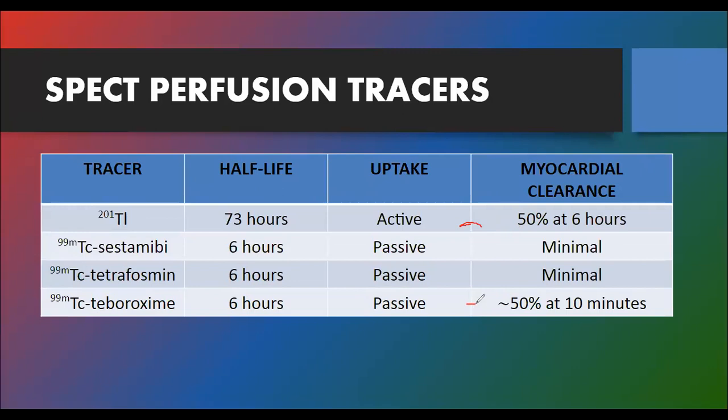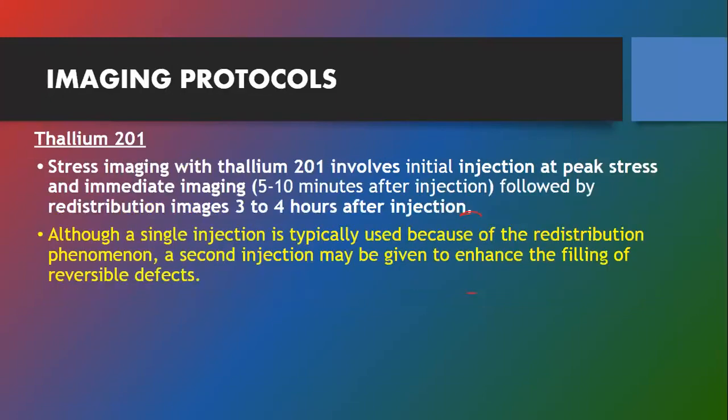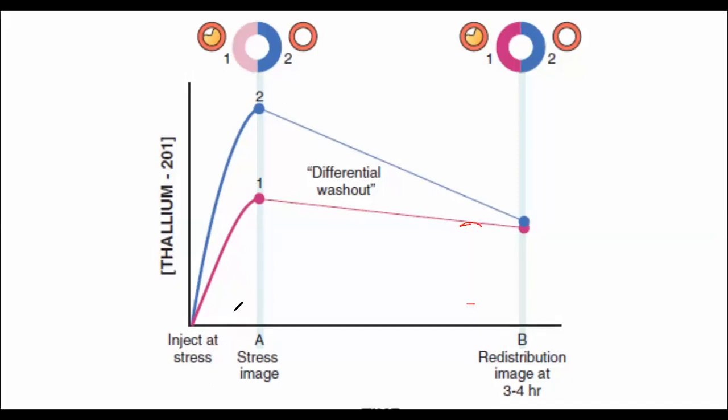As blood flows through the myocardial cells, after the tracer has entered, see this is showing the isotope entering into the myocardial cell. The red one is showing a diseased myocardium having lesser blood supply because of some coronary stenosis. There is some stenosis here, or you can appreciate it on the top as well.